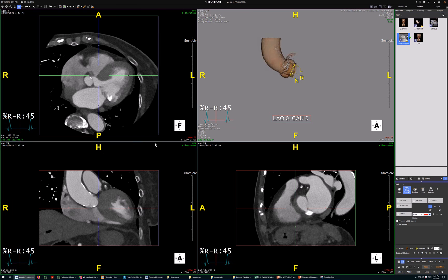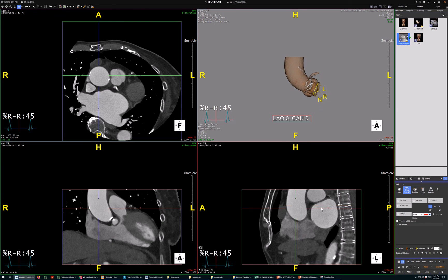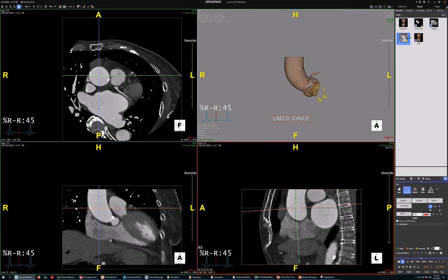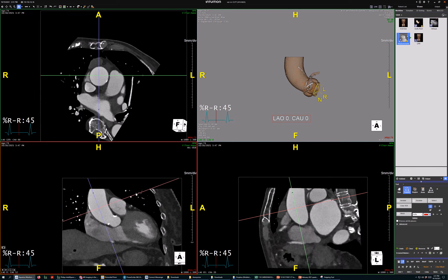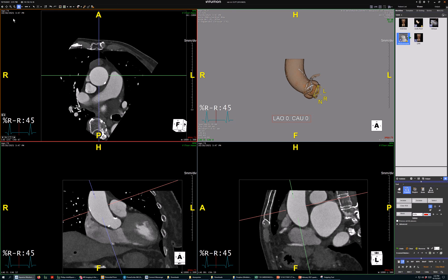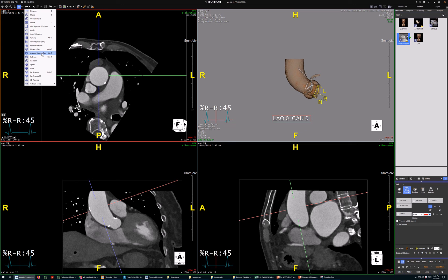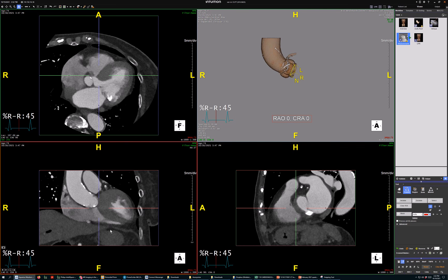Hit reset, hold the ALT key and try to find where the ascending aorta is the most dilated. There's a little bit of ectasia here, so we'll get this measurement. Assisted distance pair again. Capture. Then reset one more time.